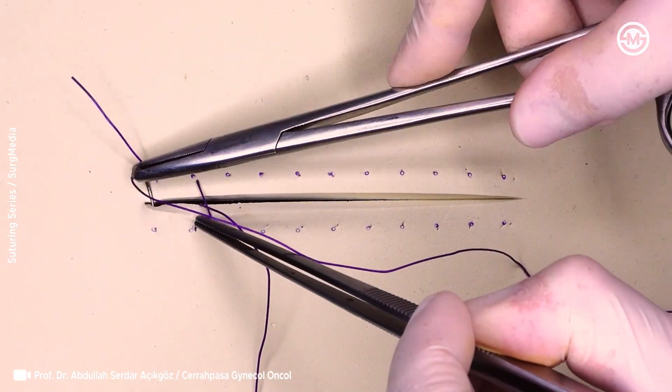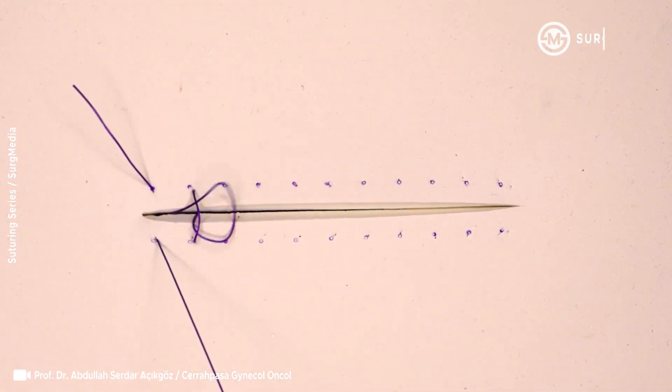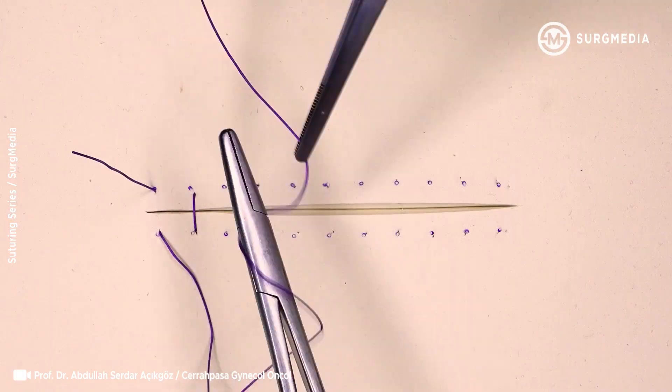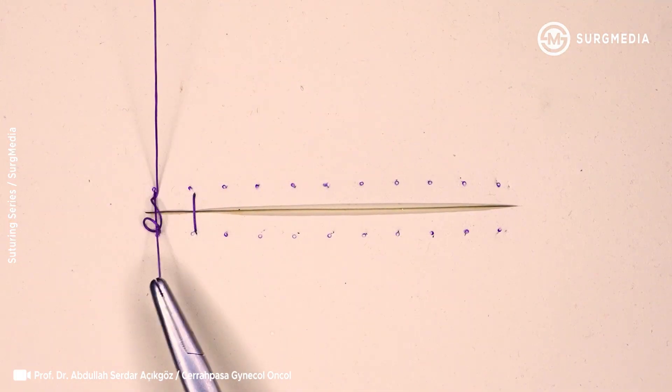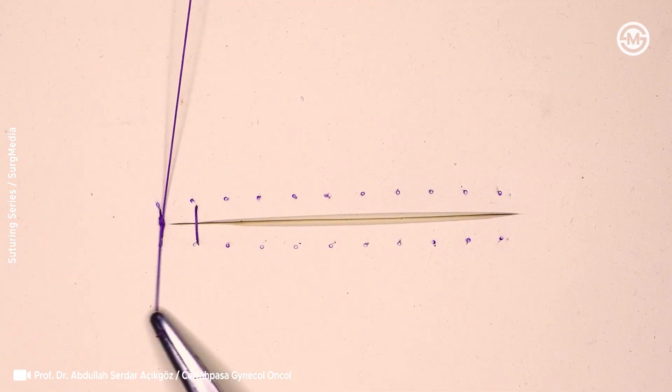To start, the first stitch passes from the outside in, near the edge of the wound. Then, on the opposite side, you place the needle obliquely, about 0.5 to 1 cm below the level of the first stitch, creating a diagonal path across the tissue.